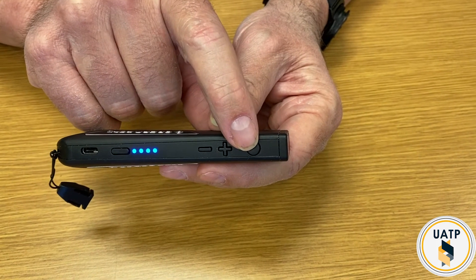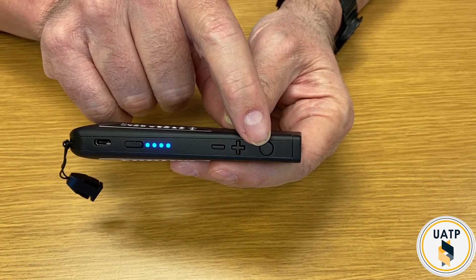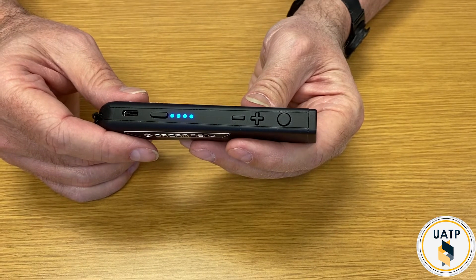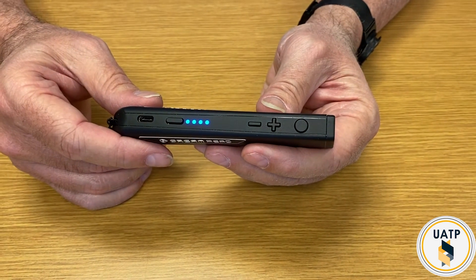This button here is called the trigger button. That's normally what you use to take the picture of the document you're wanting to look at. It also lets you accept things — if you're in a menu, you can accept or change the menu choice with that trigger button.